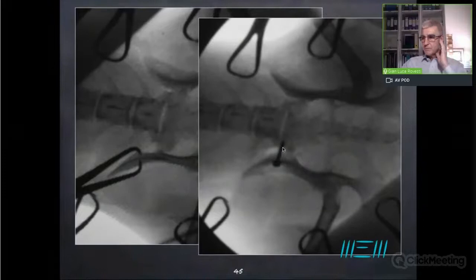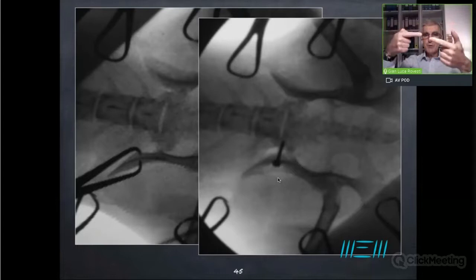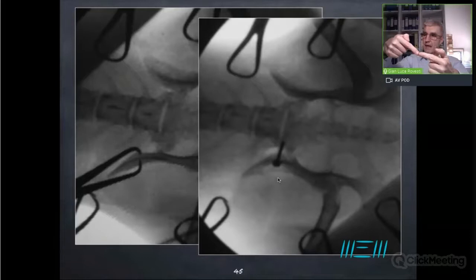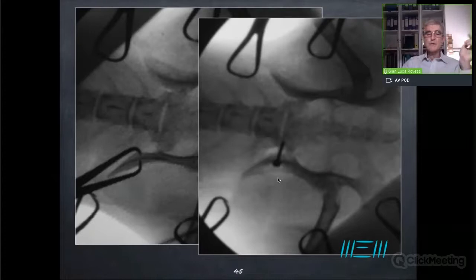Why do I use a bigger hole? That is the sliding hole, but even bigger than the sliding hole. And this is the reason why I use this washer underneath the head of the screw, for two reasons. First of all, I need a sliding hole to achieve compression. This is standard technique, but there is one more important thing. I'm not always able to follow the same axis between the two holes. If the axes of the two holes mismatch, I won't be able to insert the screw if it's fixed in this axis. A bigger hole will allow the screw to adapt to the axis of the hole in the sacrum. So the screw will slide into position spontaneously, and this will help me a lot in order to insert the screw.